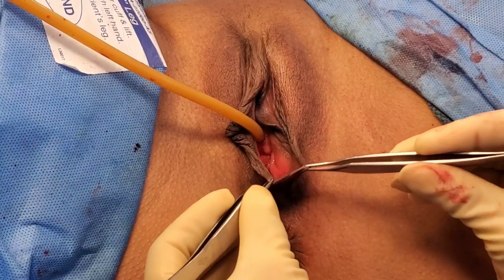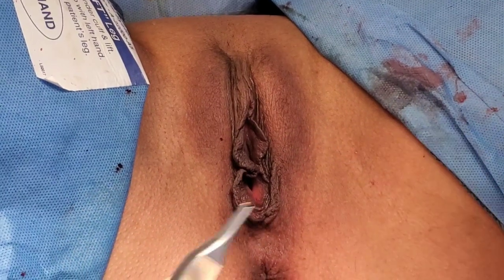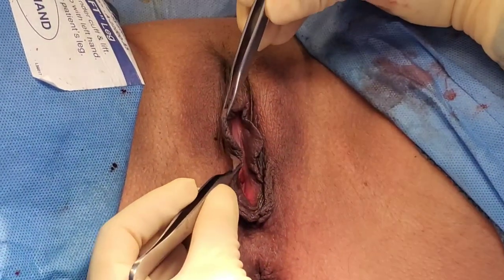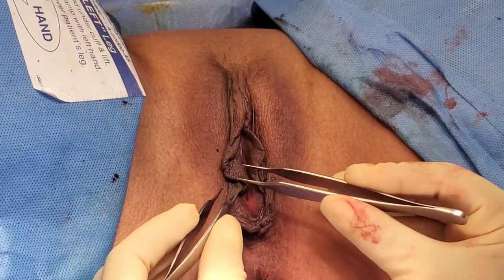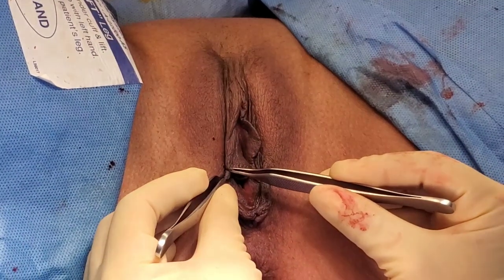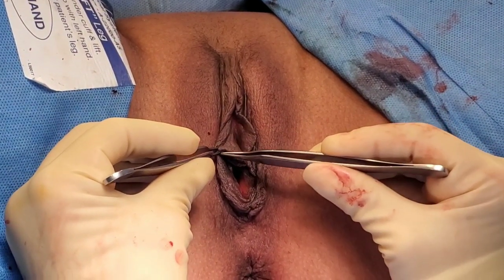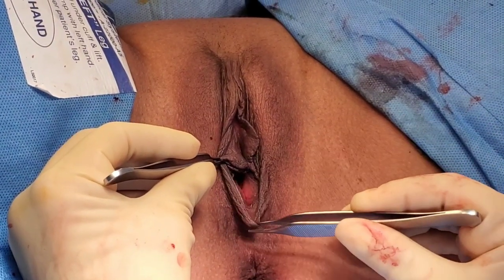All this extra tissue here I'm going to trim away. The first thing I do is I want to create symmetry. You can see that the labia minora on this side is a little bit smaller than this side. So I want to try to make it as symmetrical as possible. If I were to grab this end and bring it down here, that would make it a little bit more symmetrical, which means I have to cut this tissue out and bring this little top part to here.